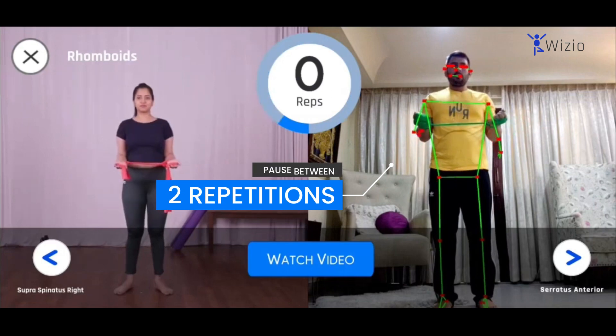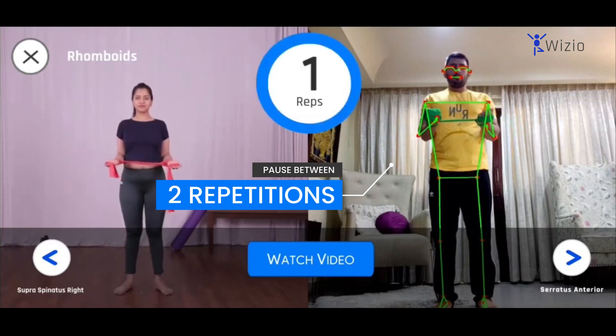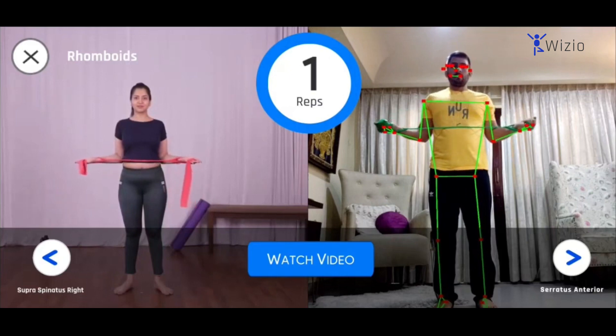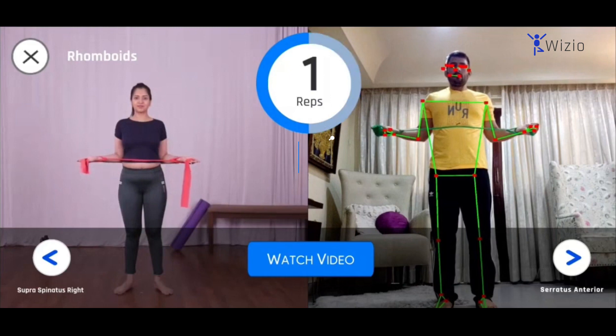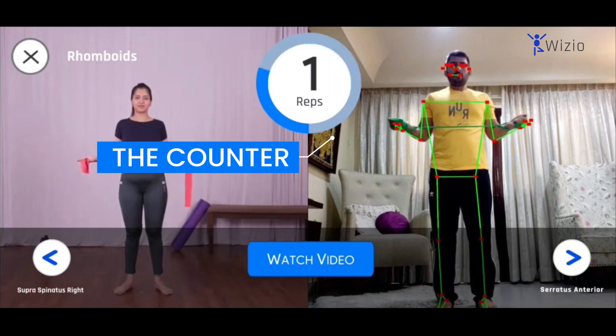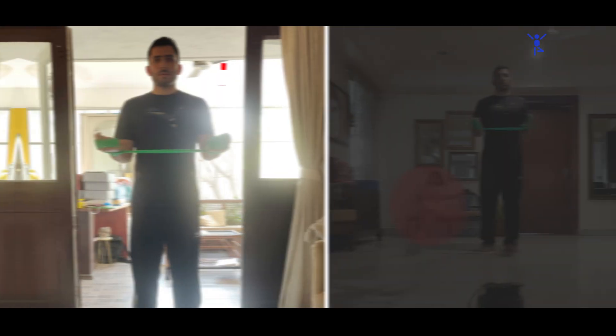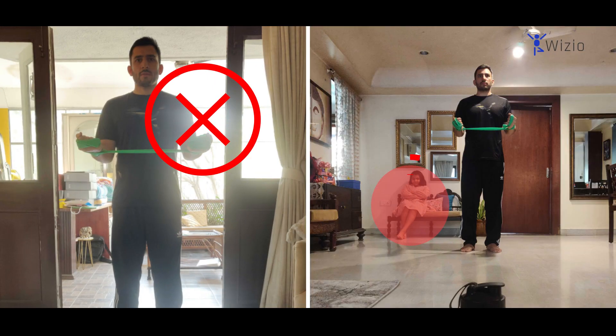Please pause for a second before starting the next repetition. If we detect an error in your exercise, you will hear an audio message highlighting the error. The counter shows the number of reps you have completed. Make sure there is sufficient light in the room and avoid any activity in the background.